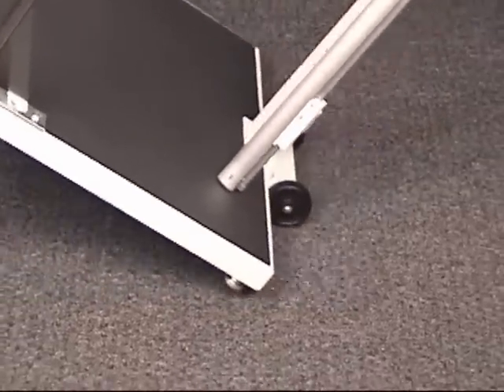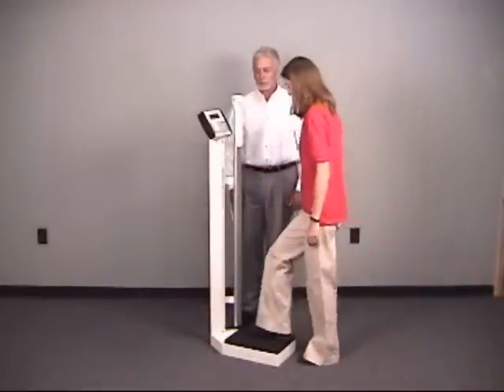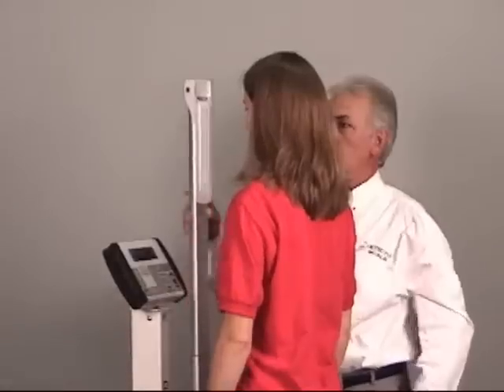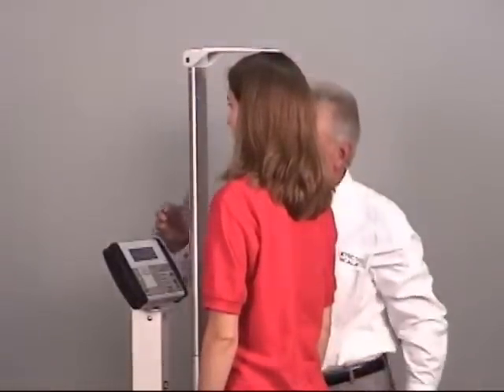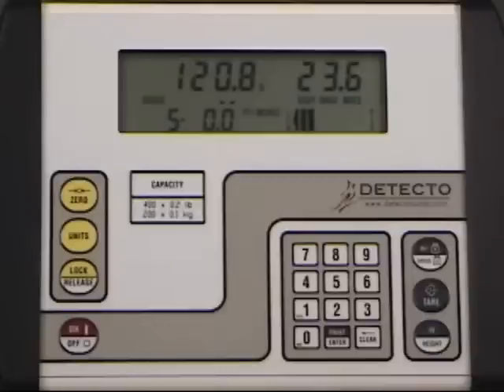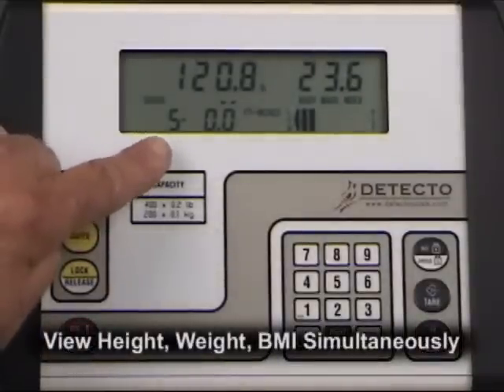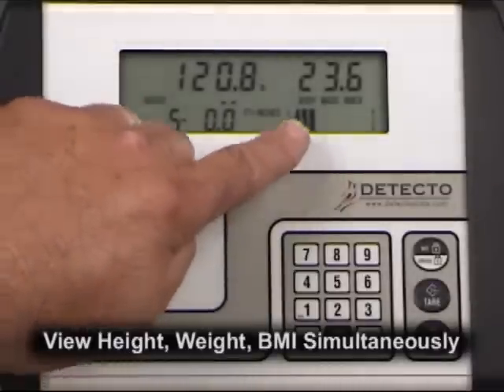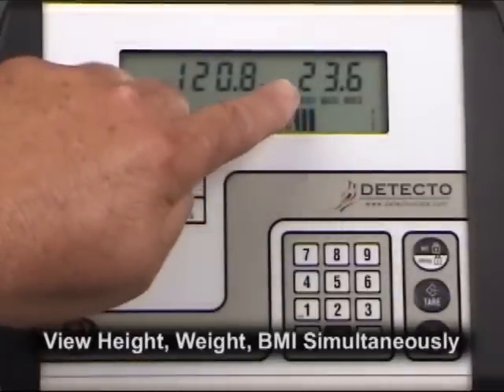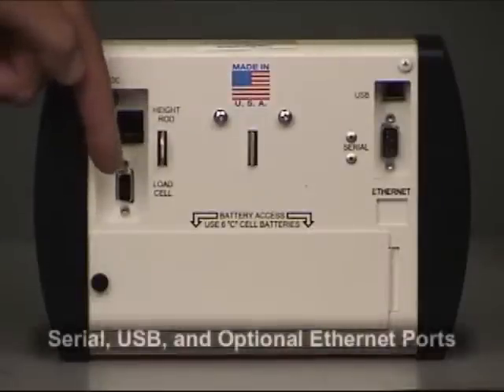The most time-efficient scale in the industry — there is absolutely no touching of keys on the weight display. Just raise the inclusive digital height rod for immediate viewing of accurate height, weight, and body mass index automatically. Just raise the digital height rod and the easy-to-read display is immediately updated with all the patient's height, weight, and body mass percentage, displayed as an easy reference bar graph.